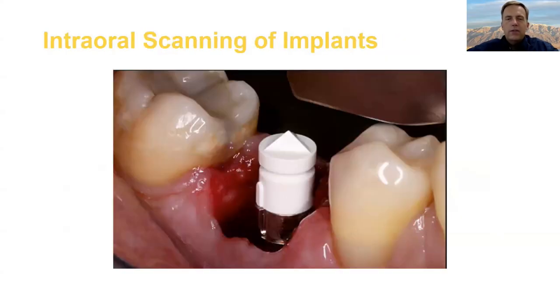Well, what if you had something that was like both? And that's like your intraoral scanner. So the first thing that's different about an IOS case is that you're going to use a component called a scan body rather than an impression coping. And you can see on this one, this is kind of a nice one here, how it has a peek surface up here so that it's easier to scan, a nice metal interface that fits in really tight with the platform to get a nice registration.